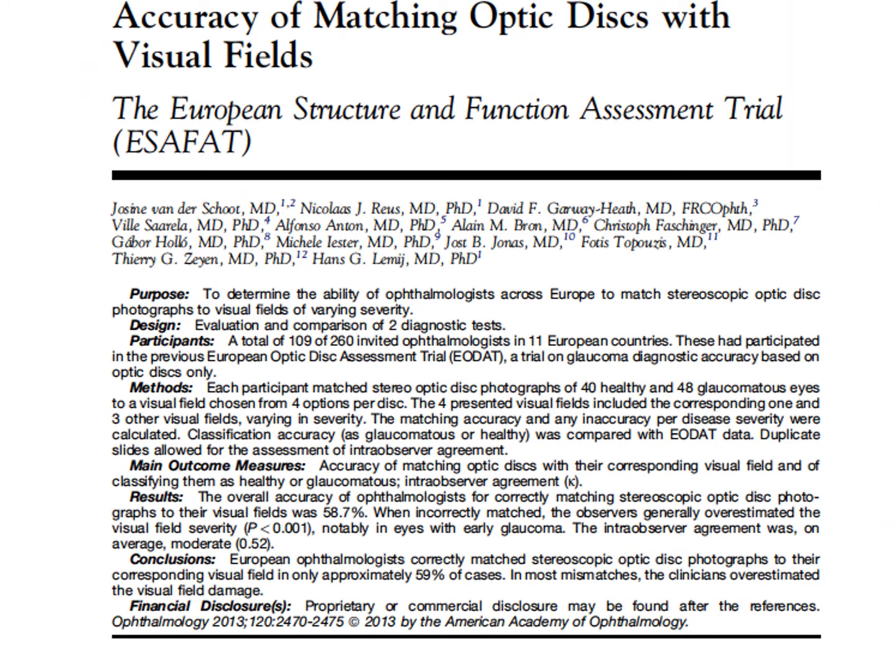In this study, we tried to evaluate the accuracy of matching optic disc with visual field. This is a multi-center study done in Europe, and we tried to match stereo optic disc photographs of 40 healthy and 48 glaucomatous eyes to a visual field chosen from 4 options for each disc.